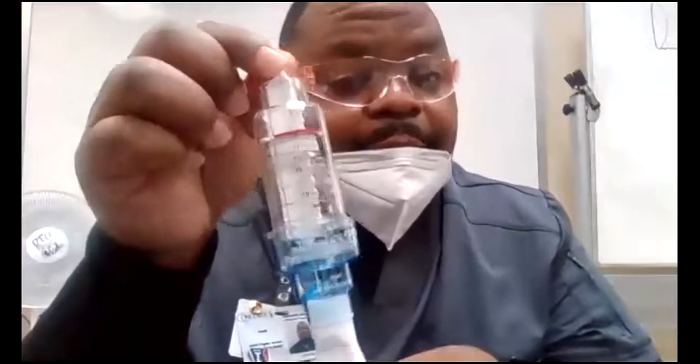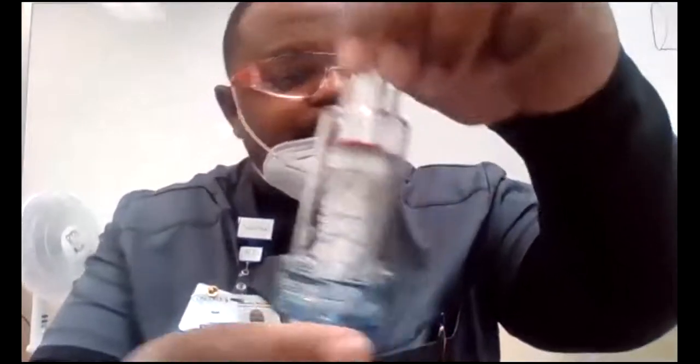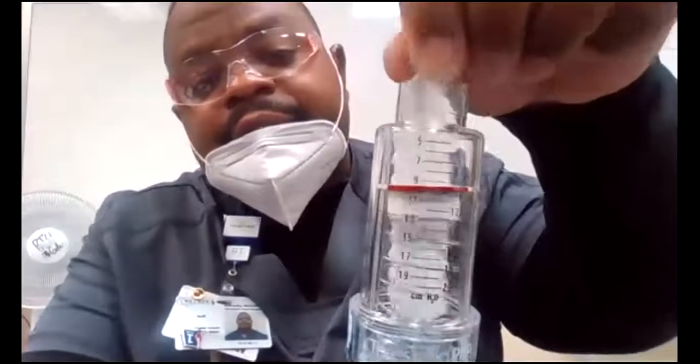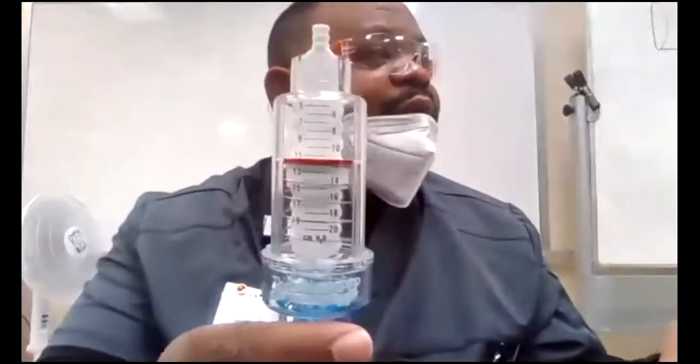And so that's the PEP device, right? It's like a way to control the pressure, right? Yeah, you can control the pressure. Whatever pressure the doctor orders, you can dial it in through here, okay? By turning this little device here, and that red line will tell me how much pressure I've got. This is 6. This looks like 10, 11, 12, 13, whatever the centimeters of water the doctor orders.